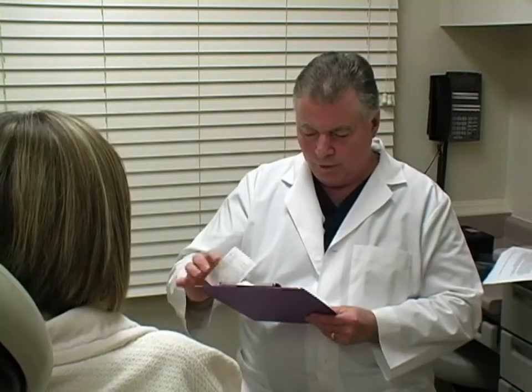What else? Well, we talked about the lumpy bumpies, okay? Talked about infection. Is it possible to get uneven results because things are not coming together in the same fashion? Yes, but again, we can fix that, okay? So that's possible. Is it possible to have those scars be permanent? We talked about that. Yes, it is. So let's go over some of the other complications, and I'll just read it off your consent form, okay? So here's what I put on here, okay?